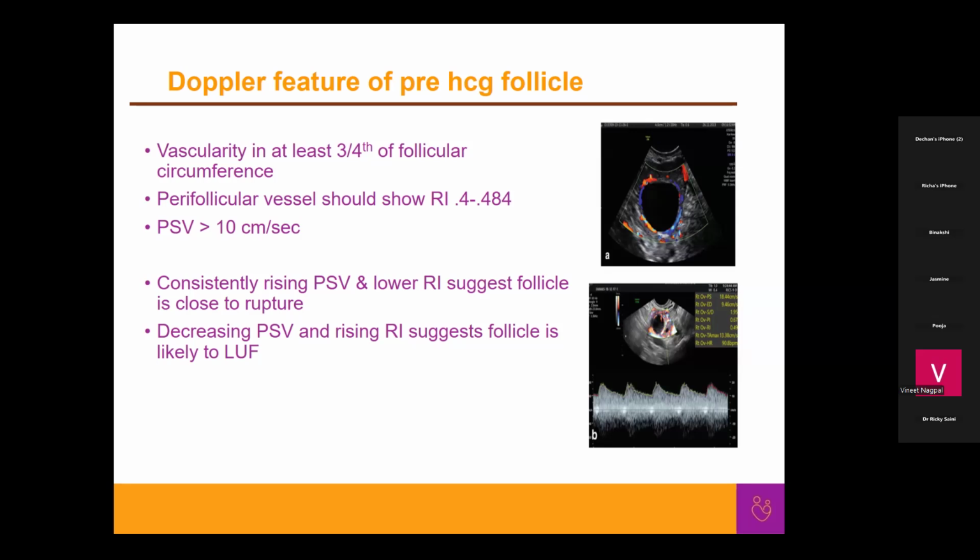Ma'am, I wanted to ask Jindal ma'am, how significant is it to do Doppler for an IUI cycle? Practically, how frequently? I mean, the learning curve is huge. If you're not able to do it, should we actually ask a radiologist to do it for us, or isn't it that important?